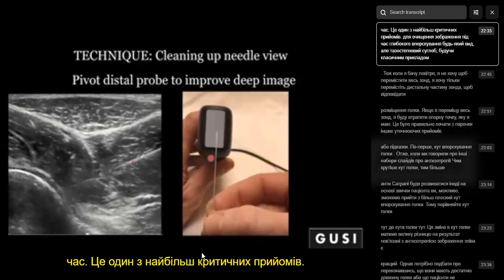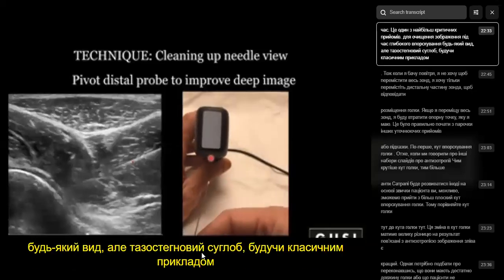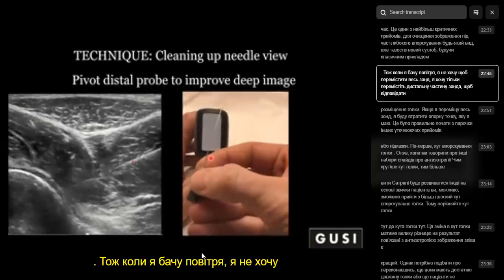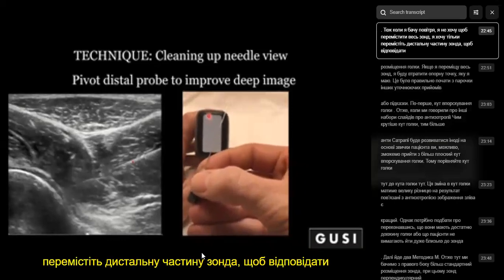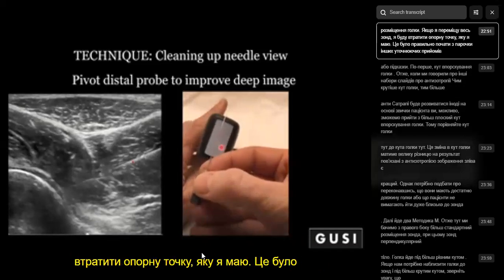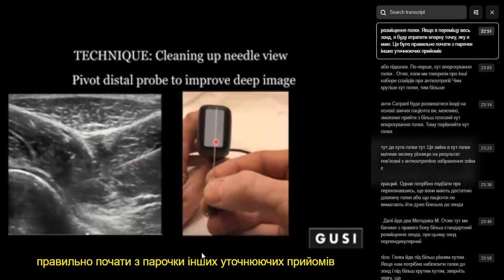This is one of the most critical techniques for cleaning up the image during a deep injection of any kind, but the hip joint being the classic example. So when I see error, I don't want to move the whole probe. I only want to move the distal part of the probe to match the needle placement. If I move the entire probe, I'll lose the anchor point that I have that was correct to begin with.